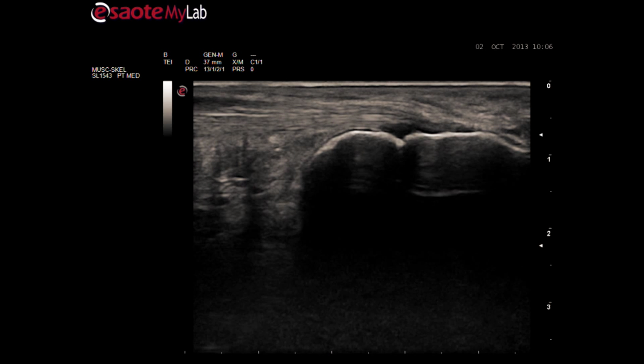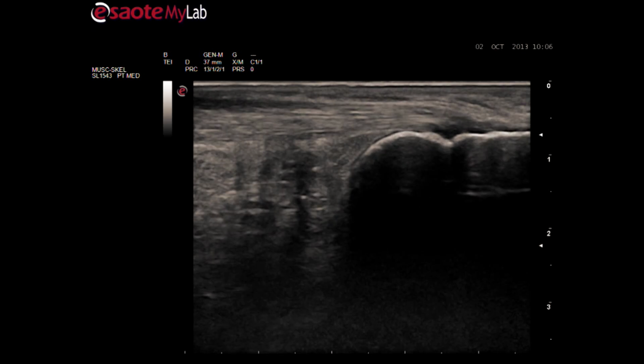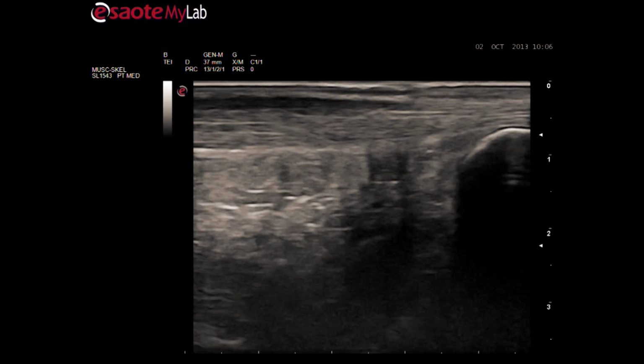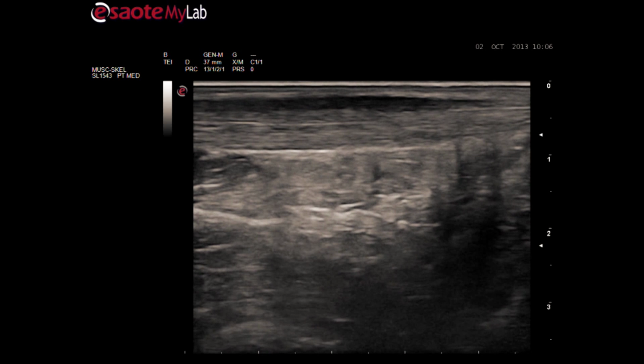We follow the Achilles tendon fibers proximally. The gray and white horizontal fibers are the Achilles tendon. Note the dark gray and black part in the superficial part of the tendon. This appears to be a zone with less quality, maybe even pathology. A healthy tendon always looks white or light gray. Black indicates an intratendinous swelling.